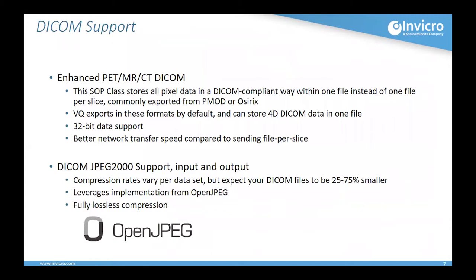A little bit about DICOM. So now we export using the enhanced DICOM SOP classes. If you don't know what that is, don't worry about it, but it does add a lot of improvements. We get potentially more resolution at the bit level with 32-bit data support. We get faster transfer speeds. VivoQuant is already pretty good about using the multi-frame module built in, but now we do it in a slightly more DICOM compliant way. And yeah, we can store 4D DICOM imaging data into one single file, which is pretty convenient.